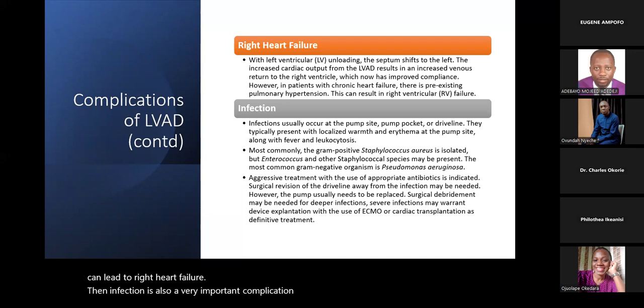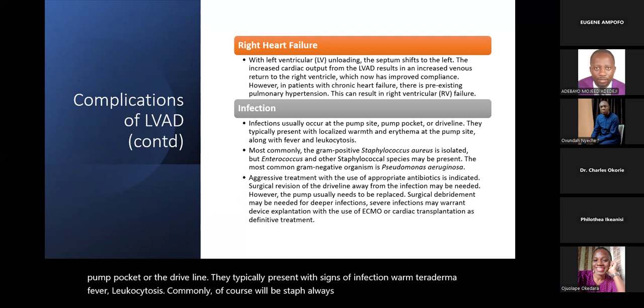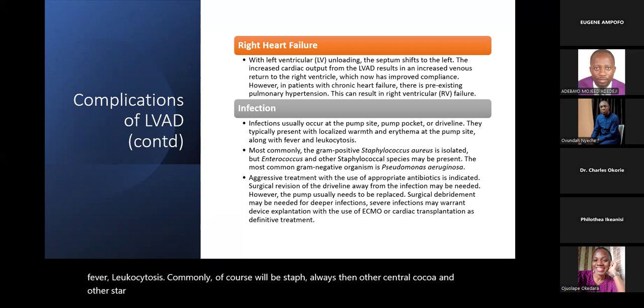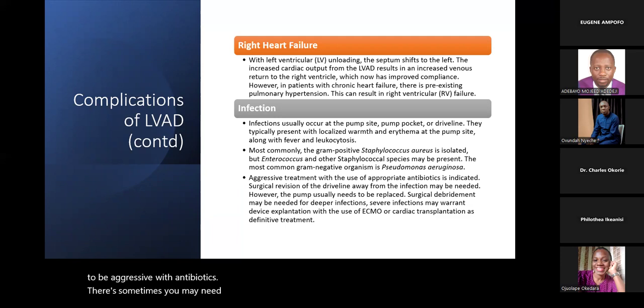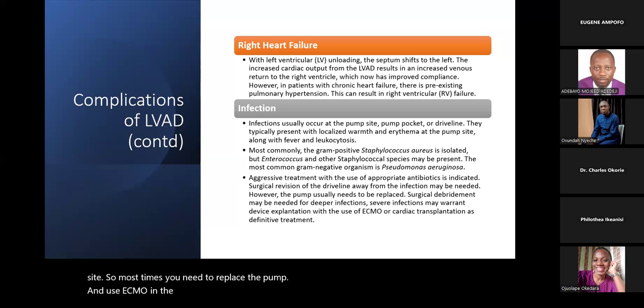Then infection is also a very important complication. Infection can occur at the pump site, pump pocket, or the drive line. They typically present with signs of infection: warmth, erythema, fever, leukocytosis. Commonly, of course, it will be Staph aureus. Then others, Enterococcus and other Staph species. Gram-negative is likely to be Pseudomonas aeruginosa. So it's good to be aggressive with antibiotics. Sometimes you may need to bring the drive line out away from the infection site. Most times you need to replace the pump and use ECMO in the meantime, or cardiac transplantation as definitive treatment.